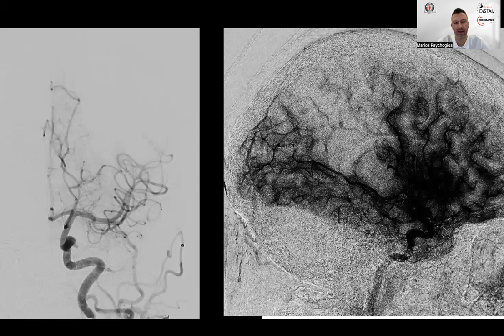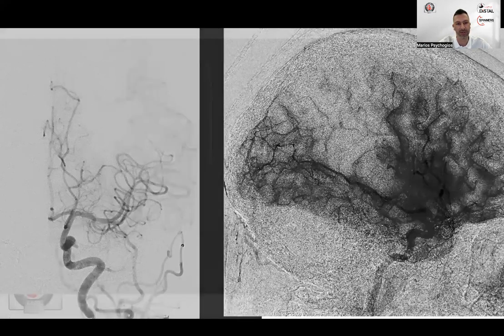So you can actually go to the M1, do a run from there, and be able to see the occlusion. This makes life easier. Or, as other people do, even do a 3D angiogram from the M1. And those lateral angiograms are really important because then you can actually see the deficit there. You can see it's a non-dominant deficit, and then you can go on and treat the patient. And after recanalization, you can also have the comparison and see if this is a better reperfusion result.